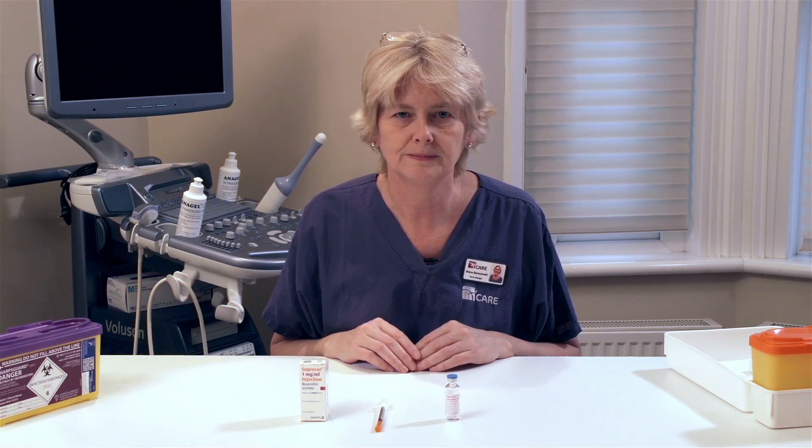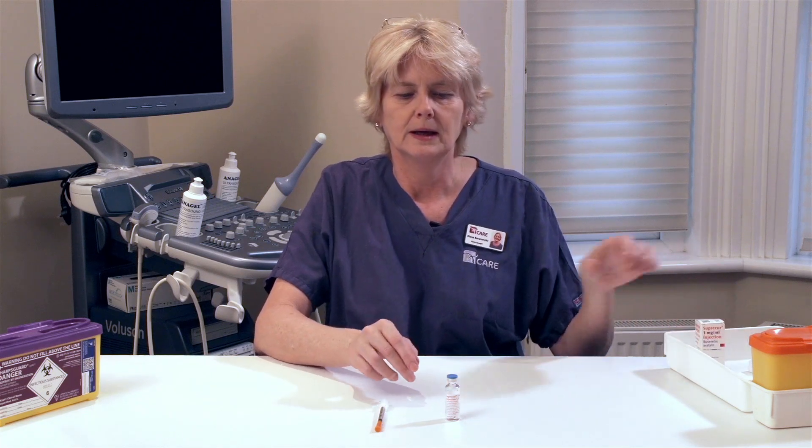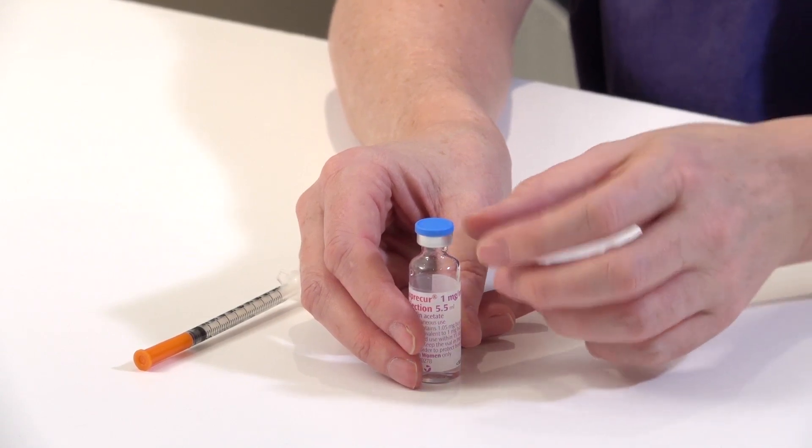I'm going to show you how to prepare and administer Suprecur, or buserelin as its other name. Remove the vial of Suprecur or buserelin from the box, and then remove the dust cap from the top of the bottle of the drug.